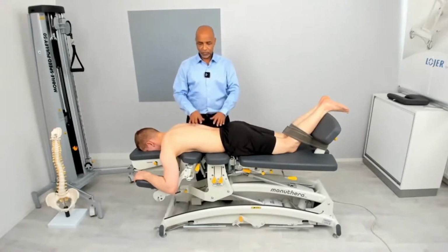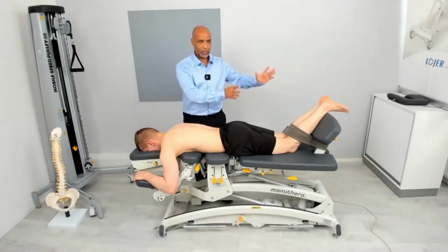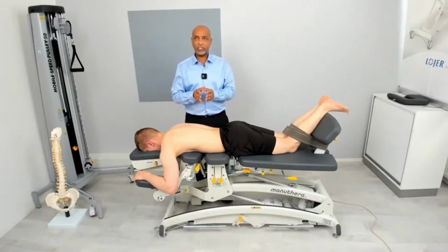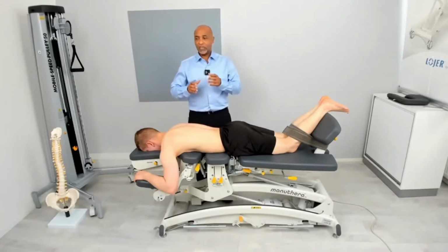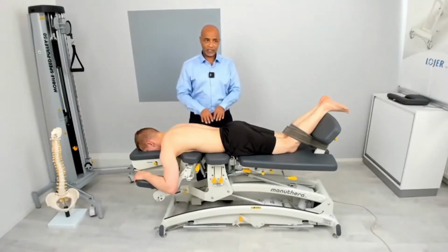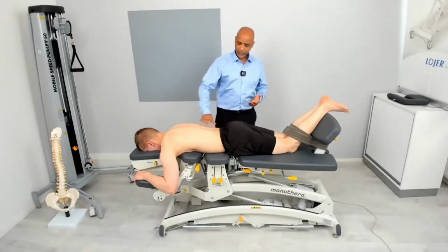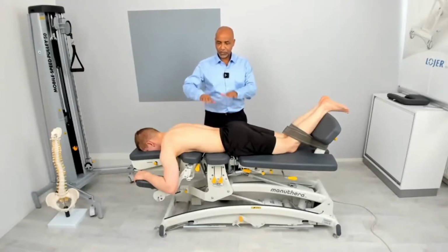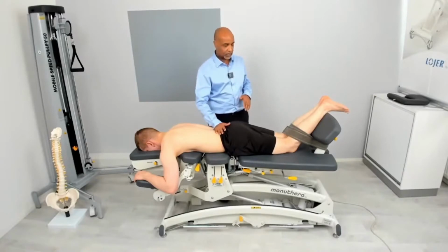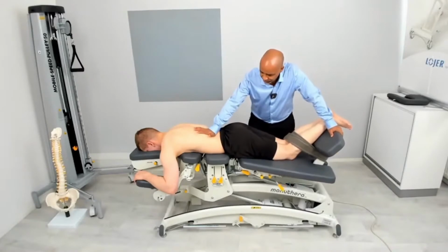Now, when you're going to approach lower back problems, you need to think about not one place, not the adjustment alone, but you need to think about what happened to that capsule, what happened to the deep muscles, what happened to the well-being of the whole synchronizing mechanism of your muscles. That means you need to pay attention to all of them. So I am going to start very gentle. I prefer to start from the top going inward or downward, which means the top is the muscles. So I'm going to start activating this lever and start to stretch very gently.